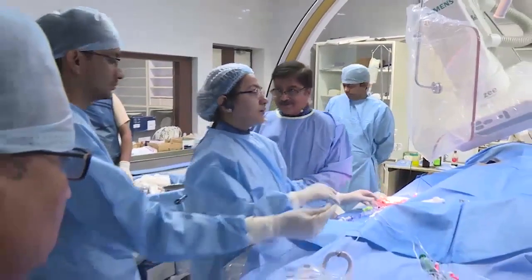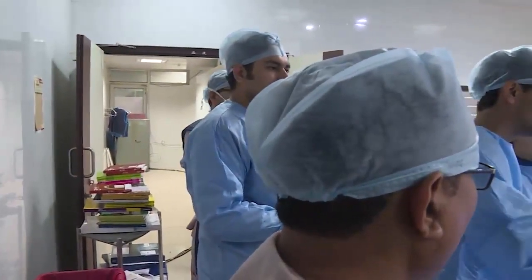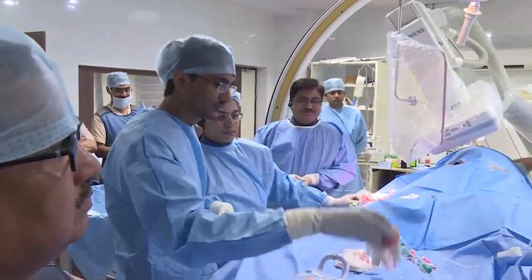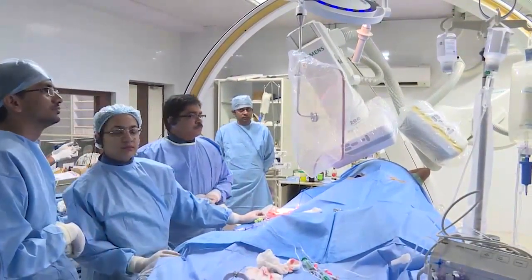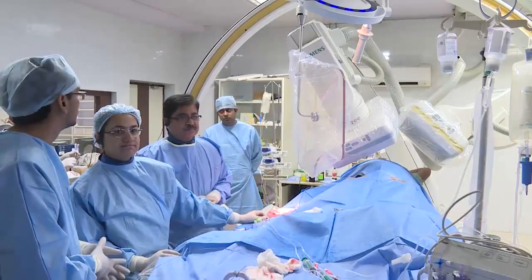Dr. Goel showed how to do a left main intervention, image guided, through the radial route, and he showed usage of a 7 French catheter through the new Terumo sheath of 6 French. And in the other lab, we learned about how to deal with a diagonal bifurcation, especially when there is calcific disease. He also demonstrated how to use the biplane, if it is available.